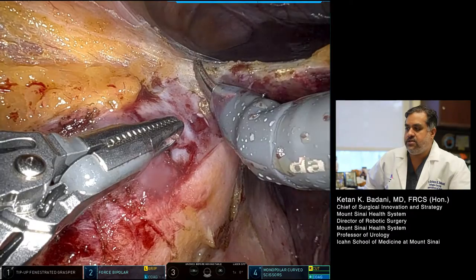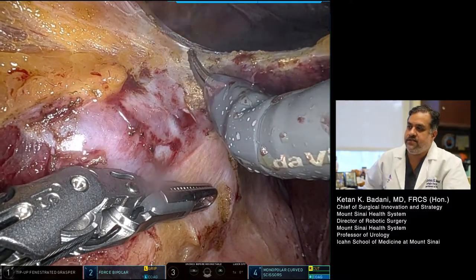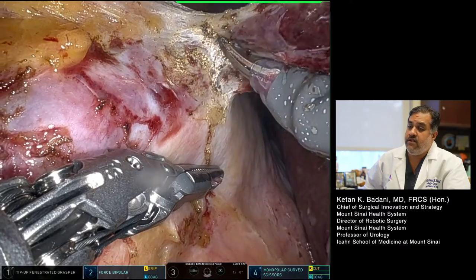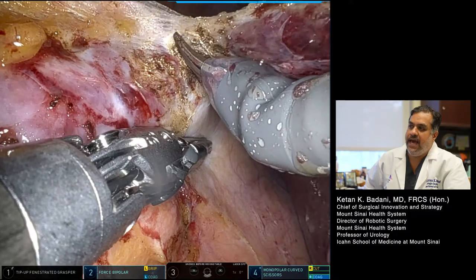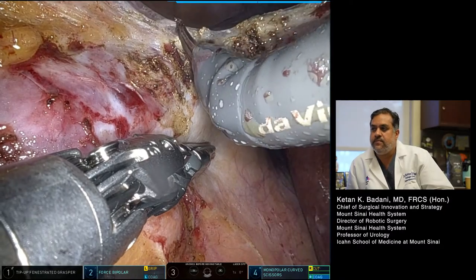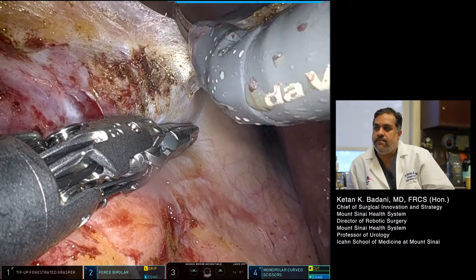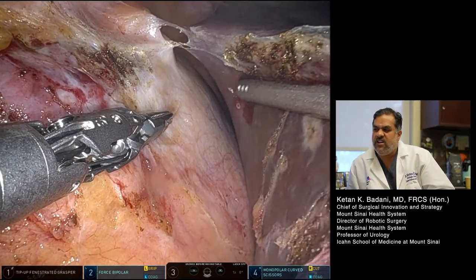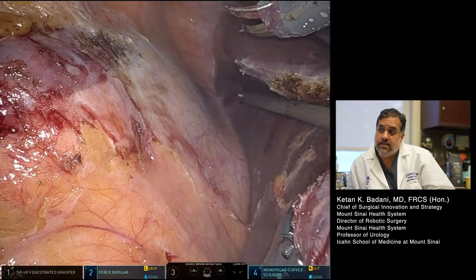My assistant is using the suction to hold the liver up so I can push on the kidney, giving traction and counter-traction. The suction instrument is actually a very good liver retractor because it doesn't poke into the surface of the liver and you have control over how much you push. Even if I'm using a liver retractor, I use the suction for active retracting during this part, then put in the locking liver retractor. Now we're completely free — although we've scuffed up the liver and kidney a little bit, we've completely mobilized it and we're good to go.